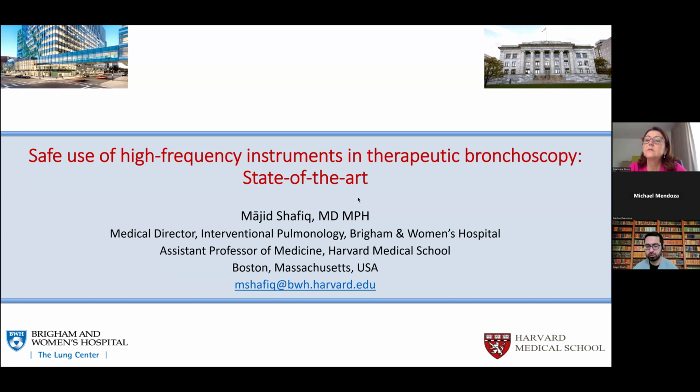So, my assistant is going to inflate the balloon just as soon as I take out my cryoprobe and make sure we tamponade the area and not take any chances. However, with the advent of the robot, I often find that just the robot itself does a great job at really occluding the airway, because you're so far out, you're so distal now that the diameter of the lumen of the airway is matched by the size of the diameter of the thickness of my robot. And so that alone, just keeping it there in between passes, does a great job at achieving tamponade, and I don't have to do anything else. So if I'm doing a really, really superficial cryobiopsy, I'm not using the Fogarty.